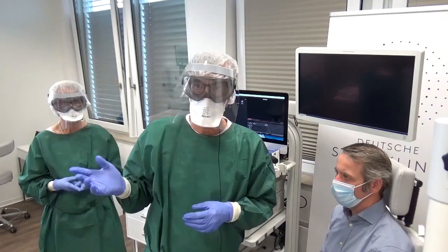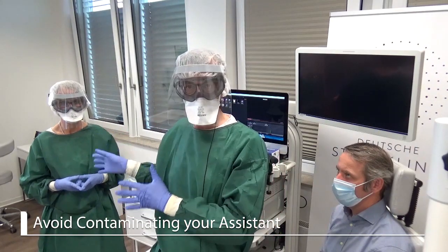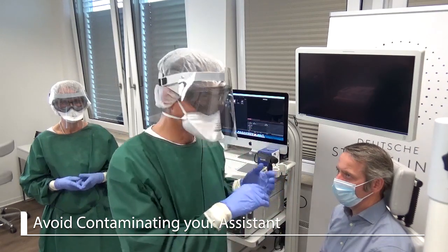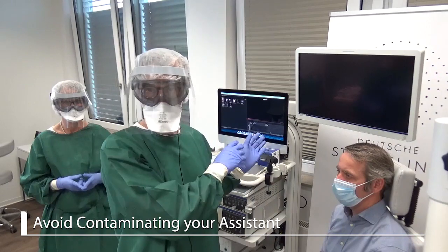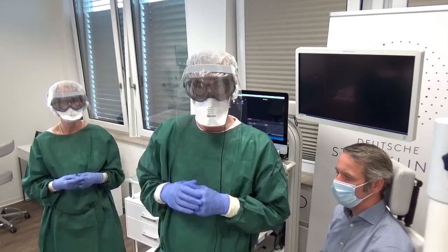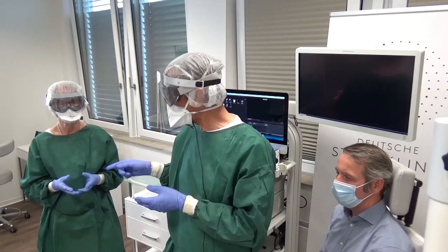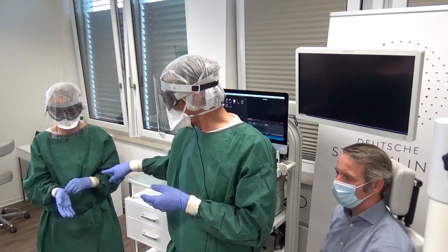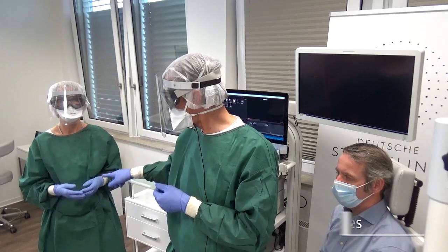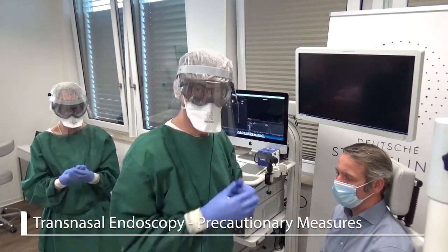The assistant — we always need an assistant. The plan is that the assistant stays non-infected so they can handle all the machines, give me the endoscope, and take the endoscope. Sometimes it happens that the assistant is contaminated, and that's why they also should have two pairs of gloves — the blue one and the yellow one. So let's start with the endoscopy.